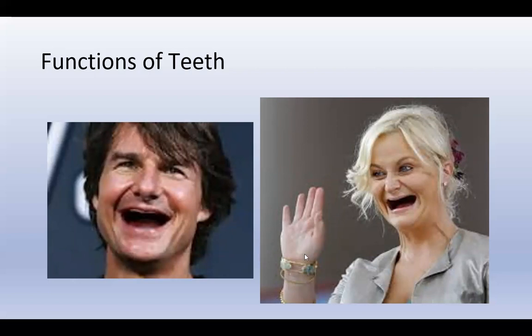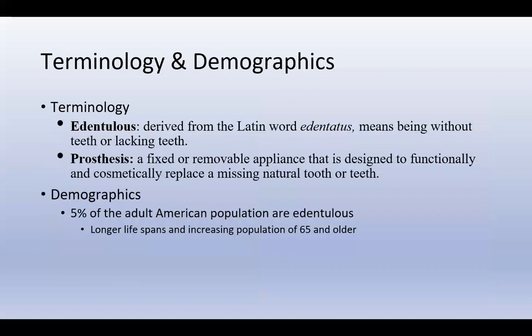Dental hygienists must be knowledgeable about how to meet the specialized needs of a patient with a prosthesis. And this could be lots of different prostheses, not just full dentures, but especially if it's a large partial or a full denture, we have to understand how to care for that and how to care for our patients' oral health who have those appliances.